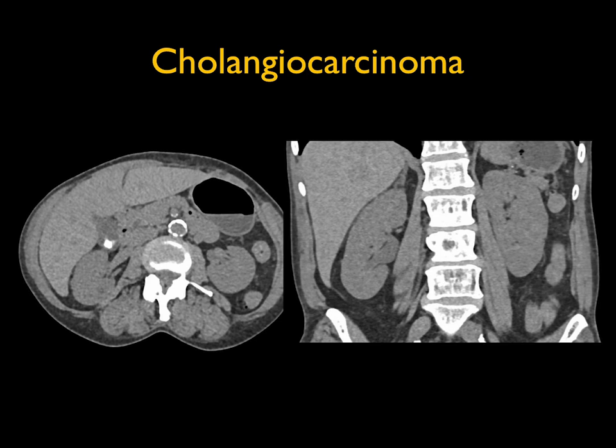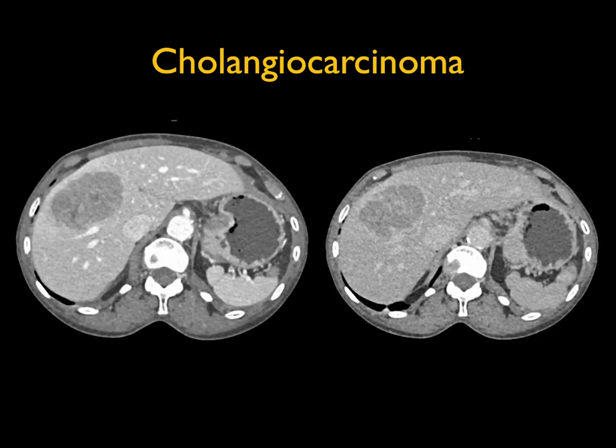Case 1 was a cholangiocarcinoma. On the non-contrast scans there's not a whole lot to see and no evidence of cirrhosis of the liver. On the arterial mapping and on the late venous you can see about a seven centimeter mass in the right lobe of the liver. It's mildly vascular but not hypervascular, and it doesn't change much between arterial and delayed or venous phase imaging, though it does seem to have a slightly enhancing rim.